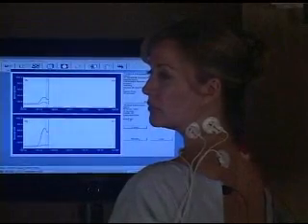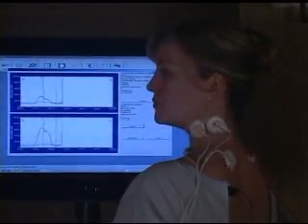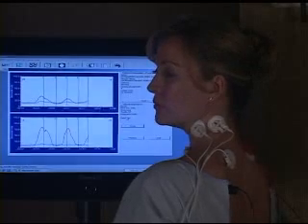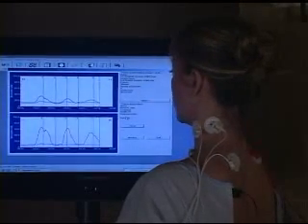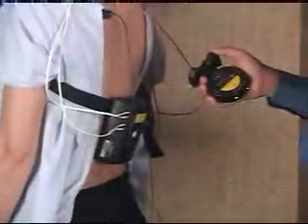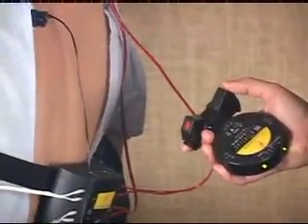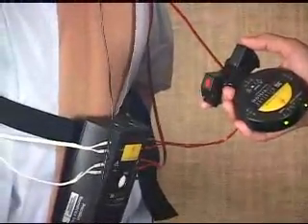Rotate to the left, mark the screen at peak, back to neutral, wait for readings to drop, mark at neutral. Go to the left, mark at the peak, back to neutral, mark at the valley. Go to the left, mark at peak, back to the center, mark at neutral, and when you're done, hold the button down for approximately 2 seconds. It'll take you to the next screen where you perform right rotation.